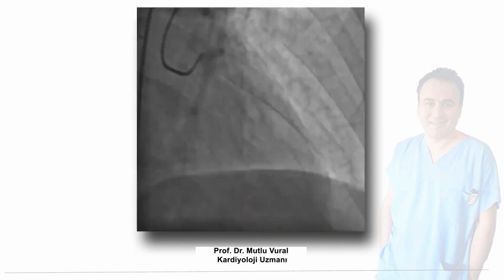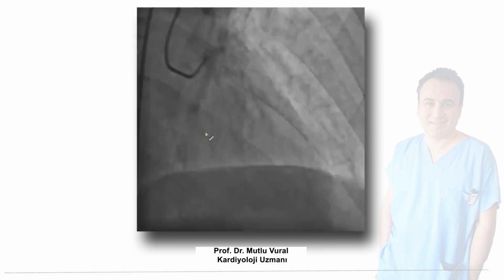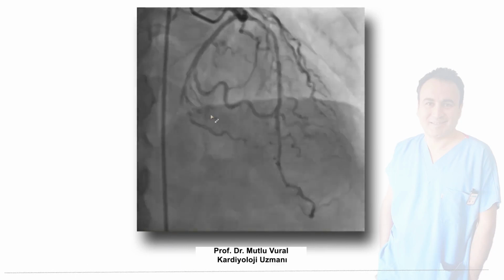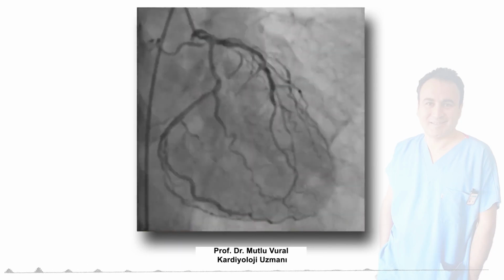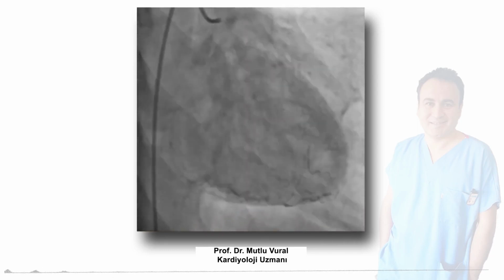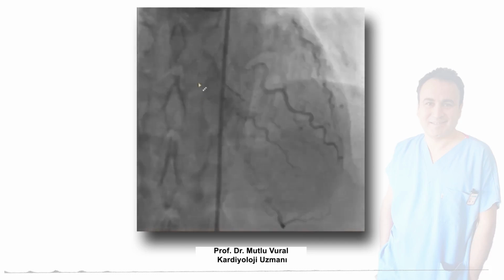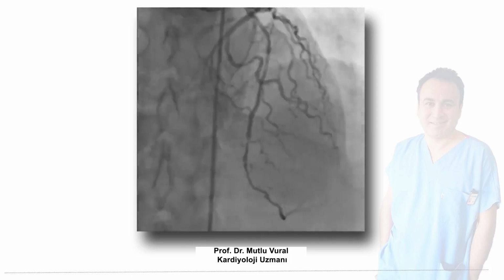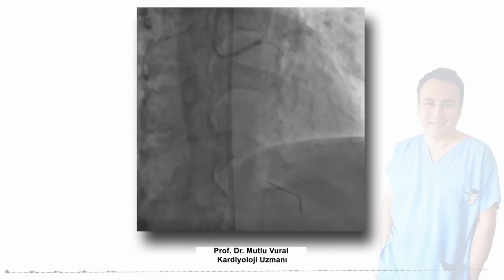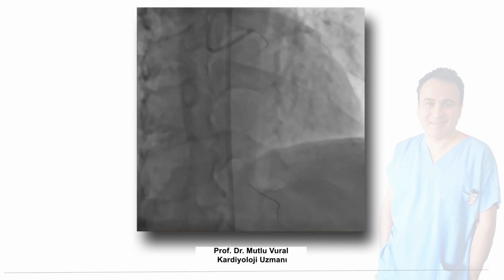At first, we couldn't realize there was a total occlusion in the distal circumflex, and we first suspected the septal 1 branch or RCA branch was a guilty lesion, but after reperfusion of the RCA, we realized that it was non-dominant.